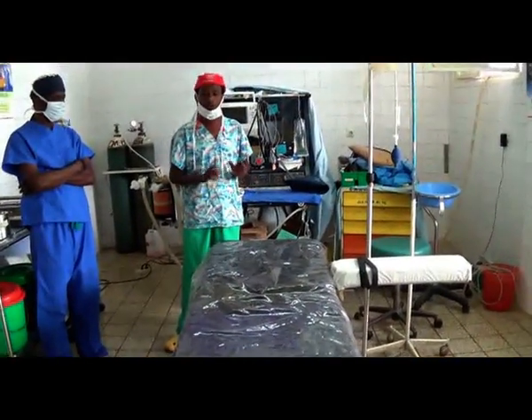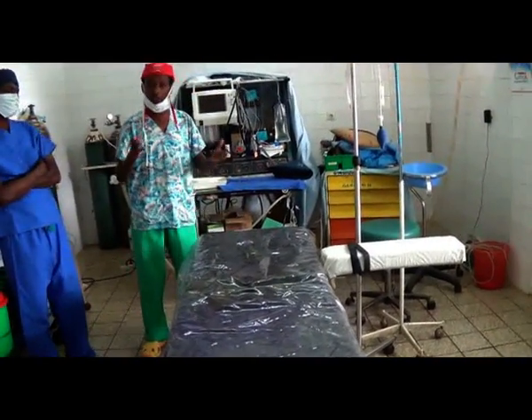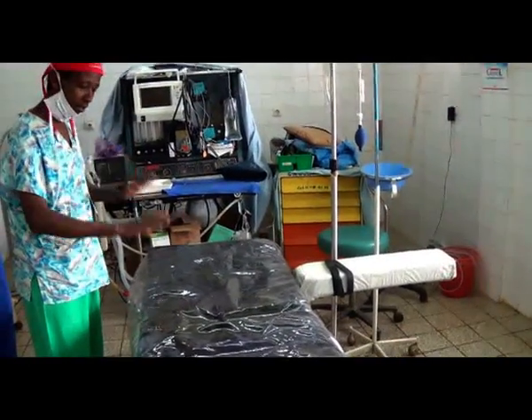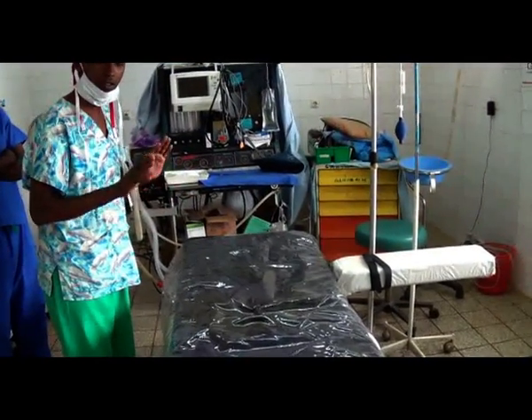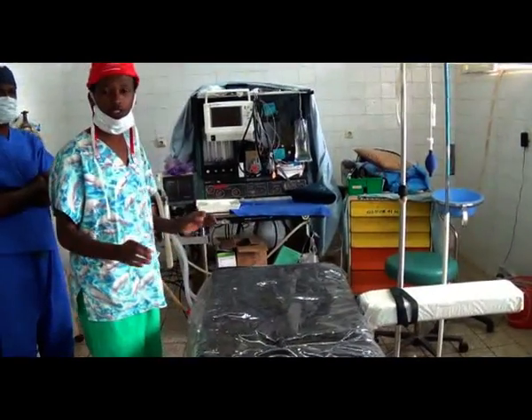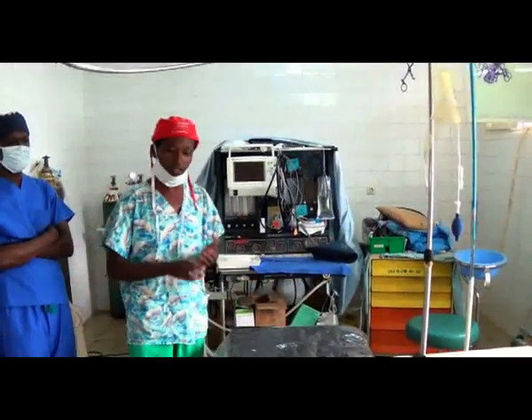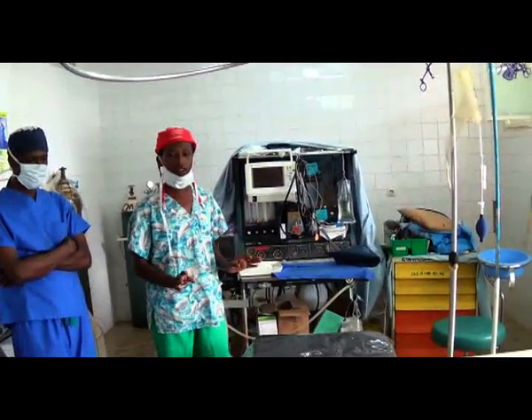It's a normal bed. It's not an OR table, because an OR table should be flexible to the right, to the left, up, down, and to the position we want. But with this one, the patient will sleep just like on any other bed, and we will operate over it. This one is not a standardized OR table. It is not appropriate for certain operations, for example nephrectomy and other operations that need a position other than supine. I cannot call it an OR table.